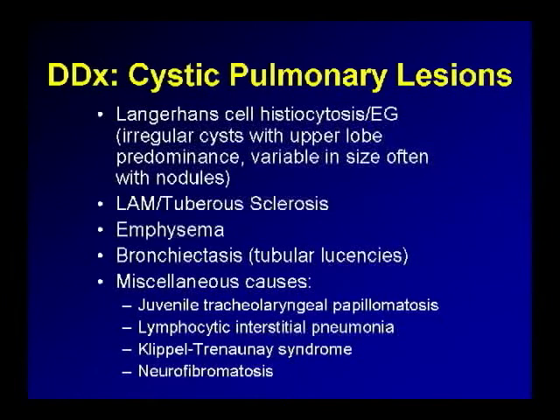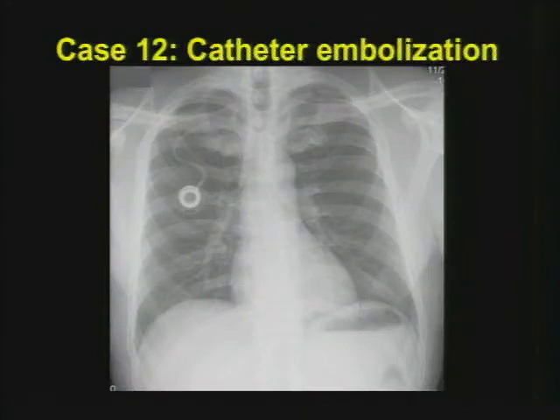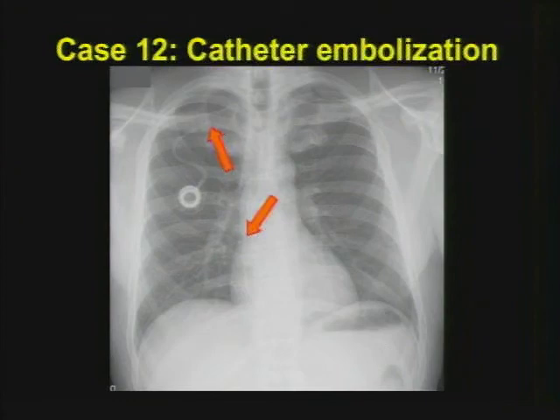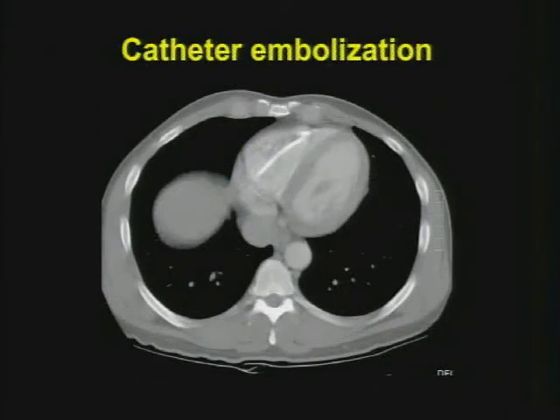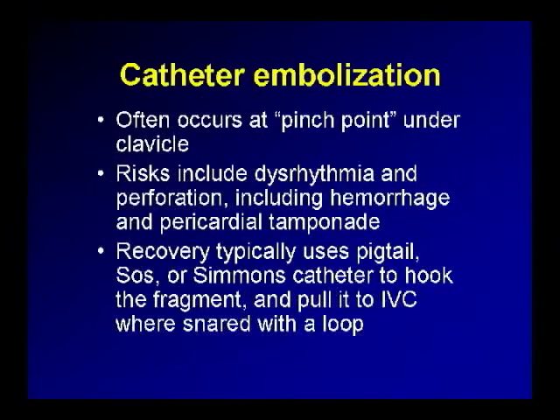Case twelve was a case of catheter embolization. This was a patient who came in completely asymptomatic, though sometimes these patients can have very severe complications. The classic location is at one of the pinch points as the catheter crosses into the thoracic inlet. By chronic motion, there can be weakness instilled into the catheter, causing it to fragment — and there's a catheter fragment sitting in the heart, visible in the right ventricular chamber on CT. The common problems to worry about are dysrhythmia, but the severe complications — though more rare — include erosion through the myocardium and pericardial tamponade, causing sudden death. You really should try to get this catheter out of the heart.